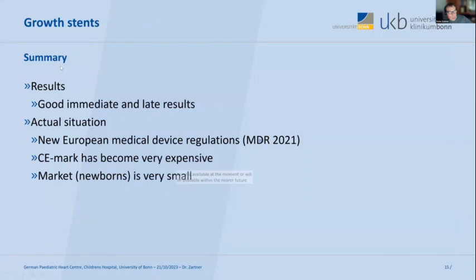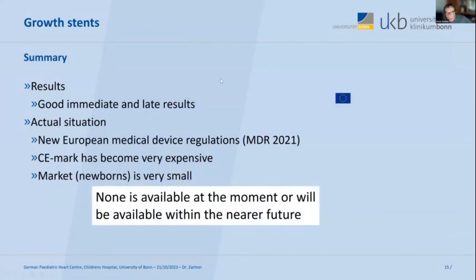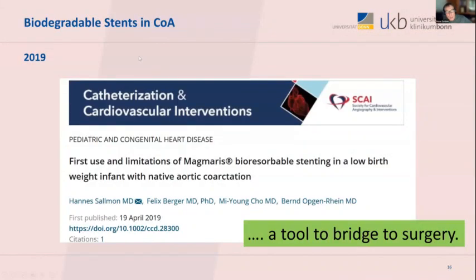But despite there being good immediate and late results with those stents, none is available at the moment, and we hope that one of those stents will be admitted to the market within the next years, but we are not sure yet.